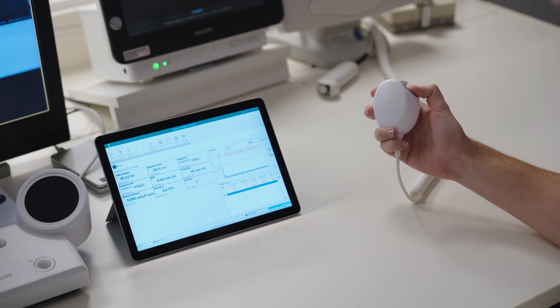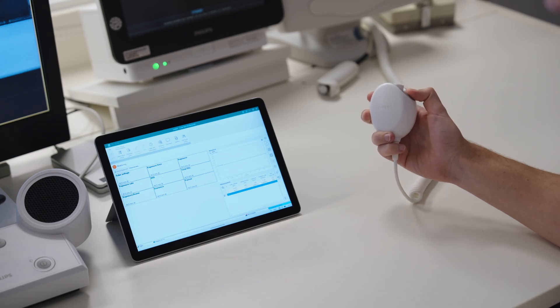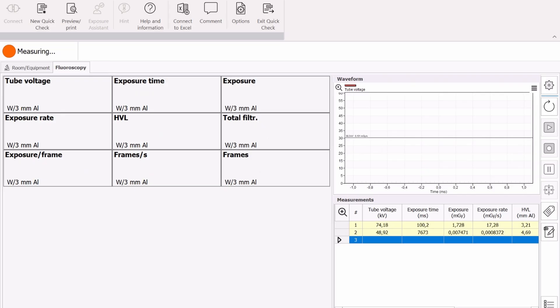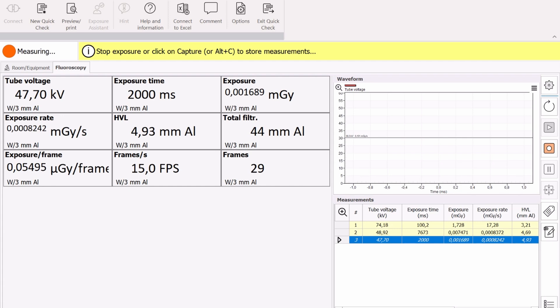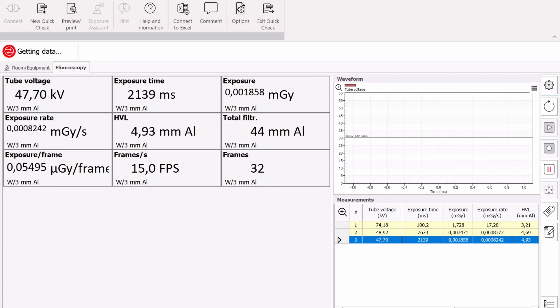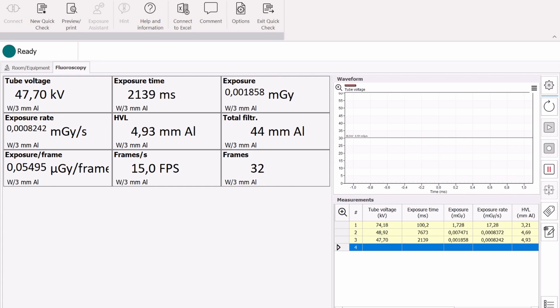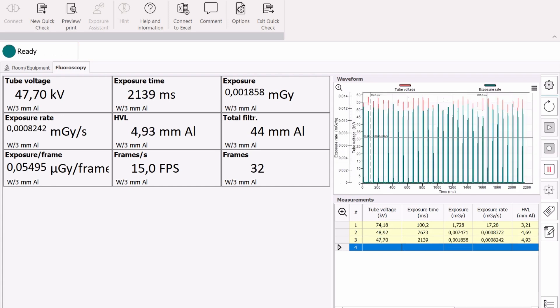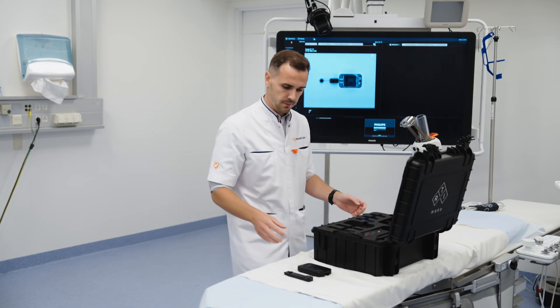Make an exposure on the x-ray system. Values for KV, exposure time, dose, dose rate, HVL, total filtration, in addition to the number of pulses, pulses per second and dose per pulse will be displayed.